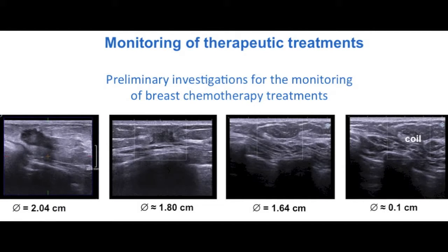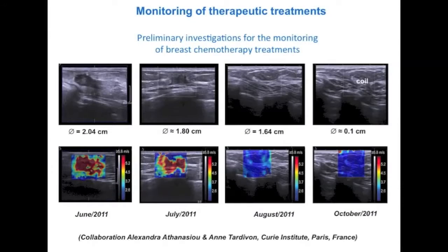If I use the same exact dynamic range, which is now possible because you have these numbers displayed next to the color scale, at time 0 and T0 plus 6 months, let's say, and if I see changes in the pattern of ShearWave, then I know that it is because the organ has changed, the lesion has changed. Interesting.